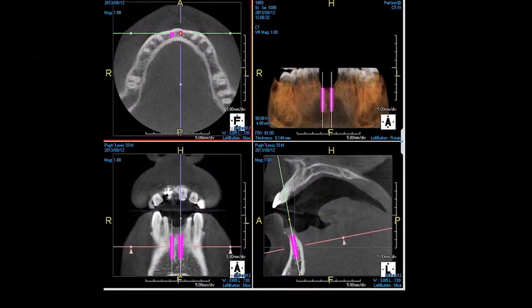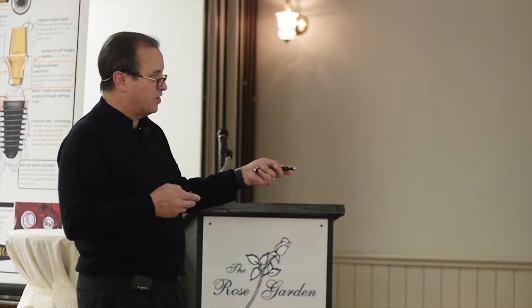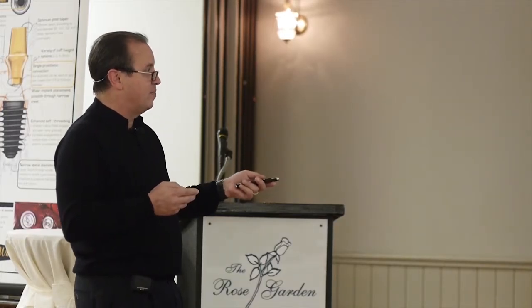Sometimes the best thing to do is just to put 1 in and then cantilever a tooth off the side rather than getting too close to these adjacent teeth. But with a scan, you can determine ahead of time if you really do have enough room to work with.